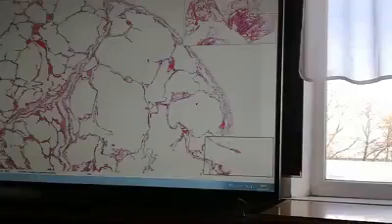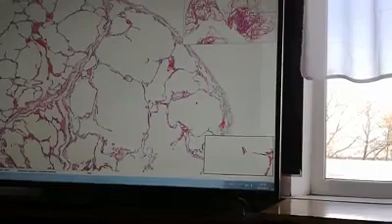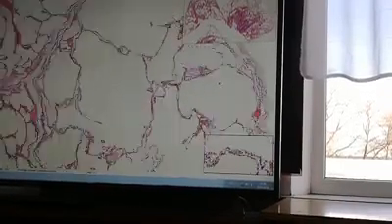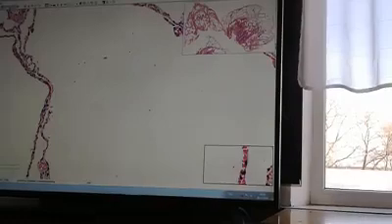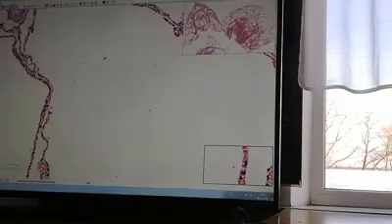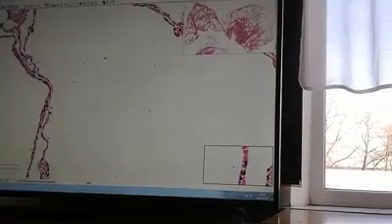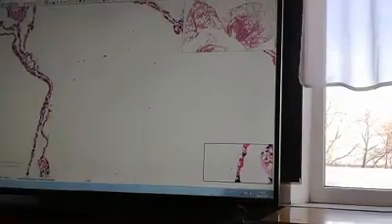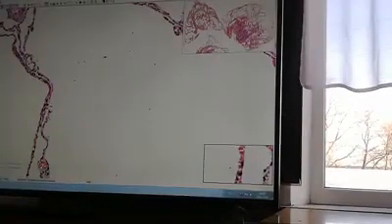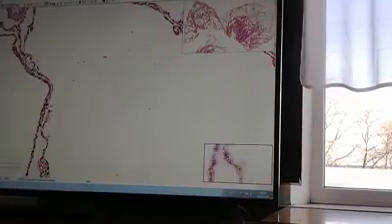The interalveolar septa in these distended alveoli become thinner due to compression from the air, but also if we make a specific stain for collagen fibers, we can detect that in all interalveolar septa there is a lot of connective tissue. It's due to hypoxia, due to compression, due to dystrophic changes, and that's why sclerosis will start in the interalveolar septa. So thickness is decreased, but the septa is replaced with connective tissue.